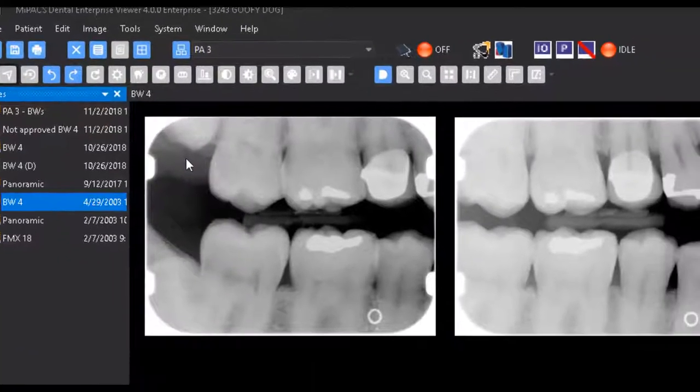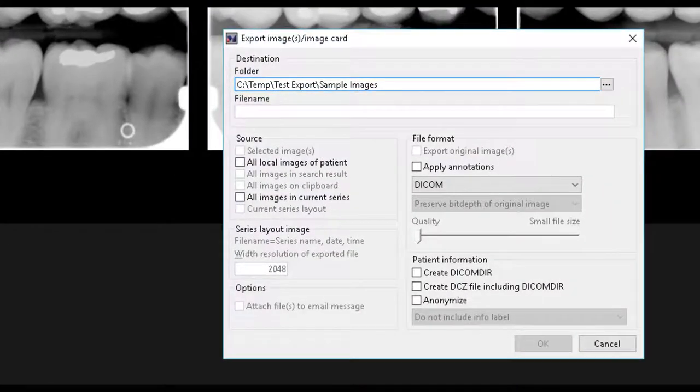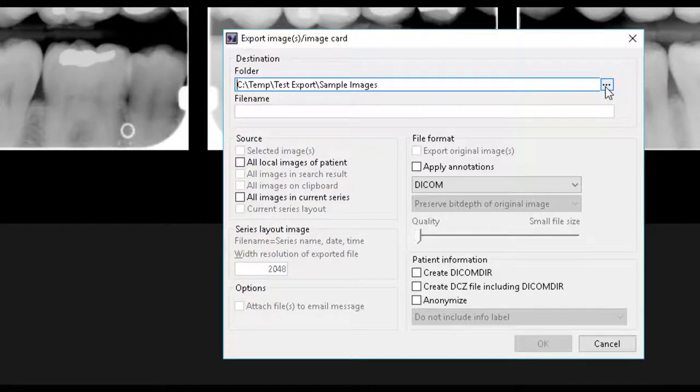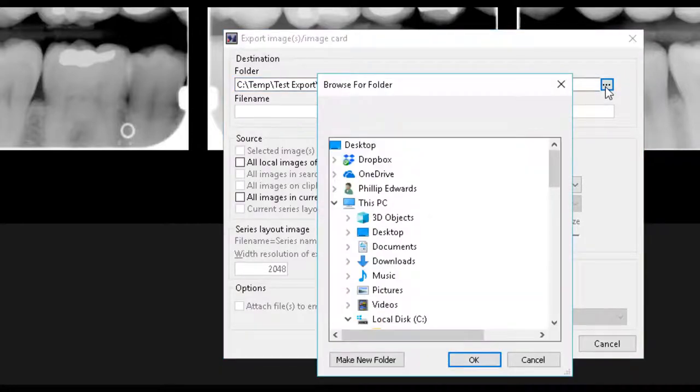The Export Images dialog is very similar to the Print dialog. First, you will want to select a destination folder. You can use the Browse button to help navigate to the appropriate folder.